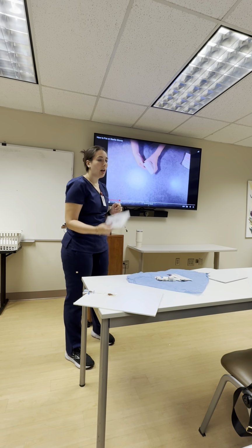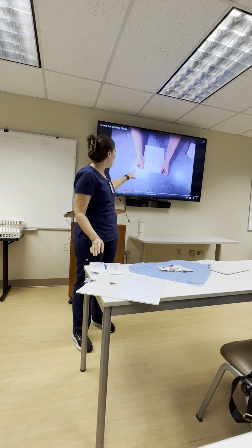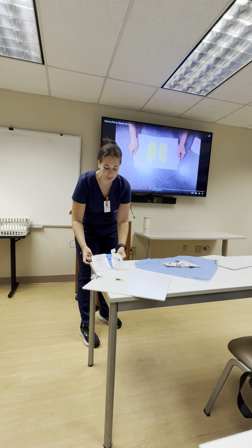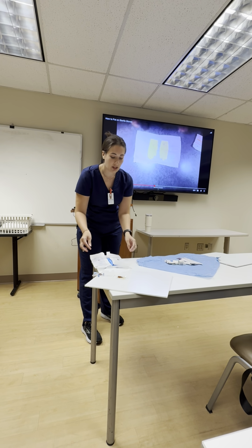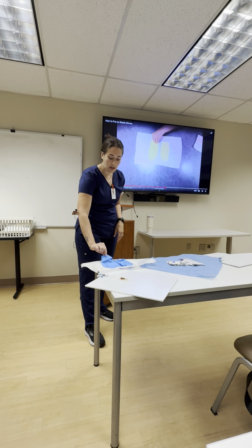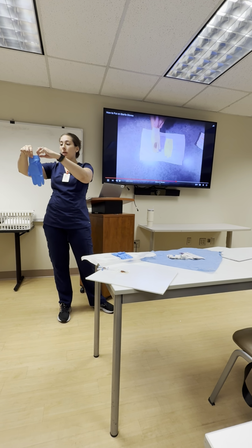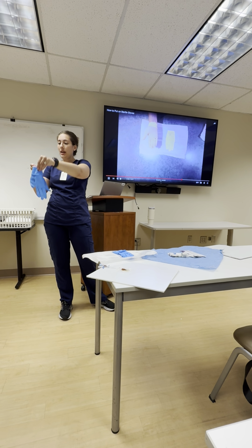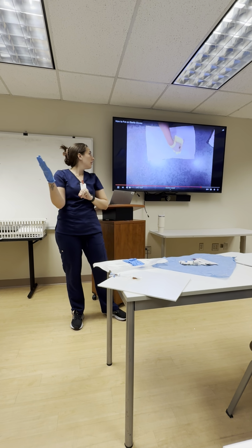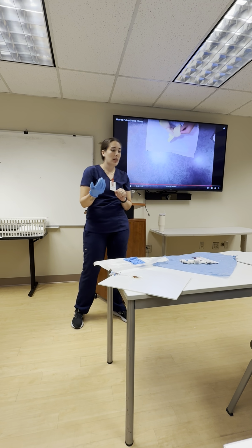So you're going to take your sterile gloves, everyone have some? And you're going to open and unfold it. I like to open the top and the bottom just because it prevents the paper from flinging back closed. Once you have that, you're going to grab the folded part with your hand. This is sterile, but this folded part will no longer be sterile. So you're going to grab it with your non-dominant hand and slide your hand inside the glove. Now, if your fingers don't go in all the way, that's okay. We're going to worry about that when we put the second glove on. We can adjust our fingers.